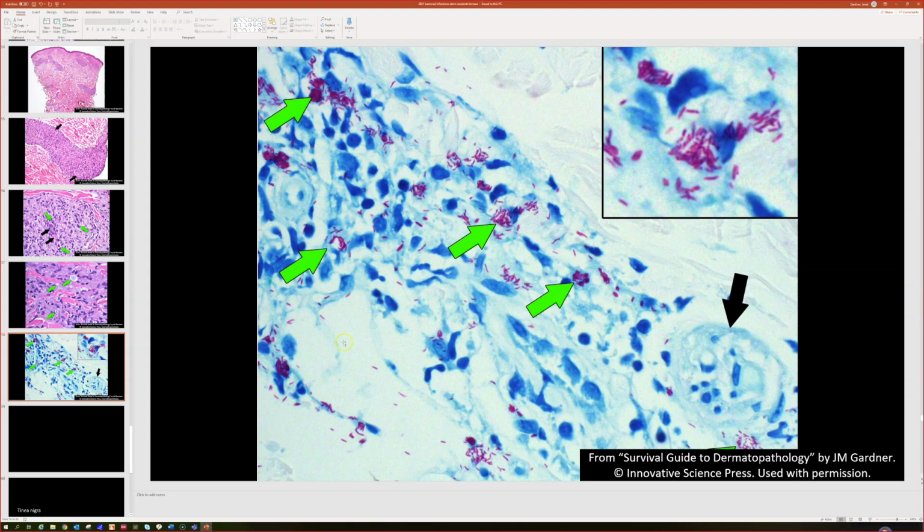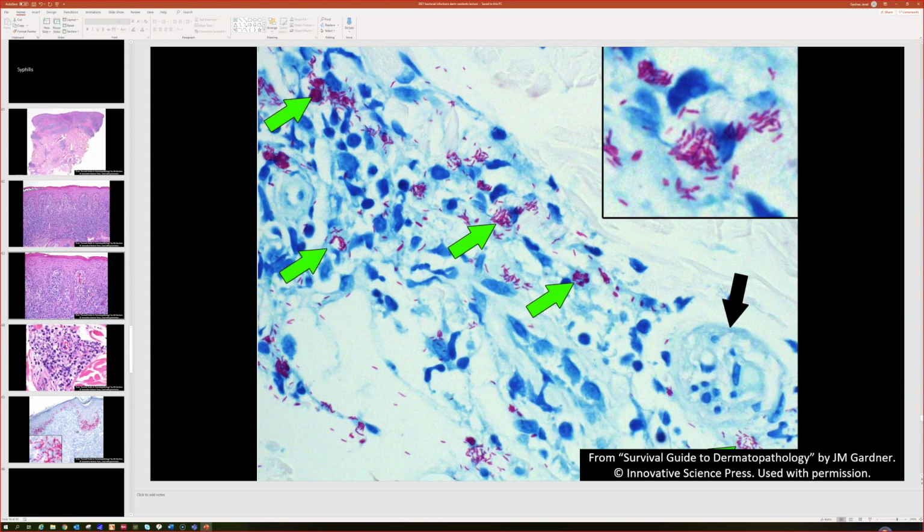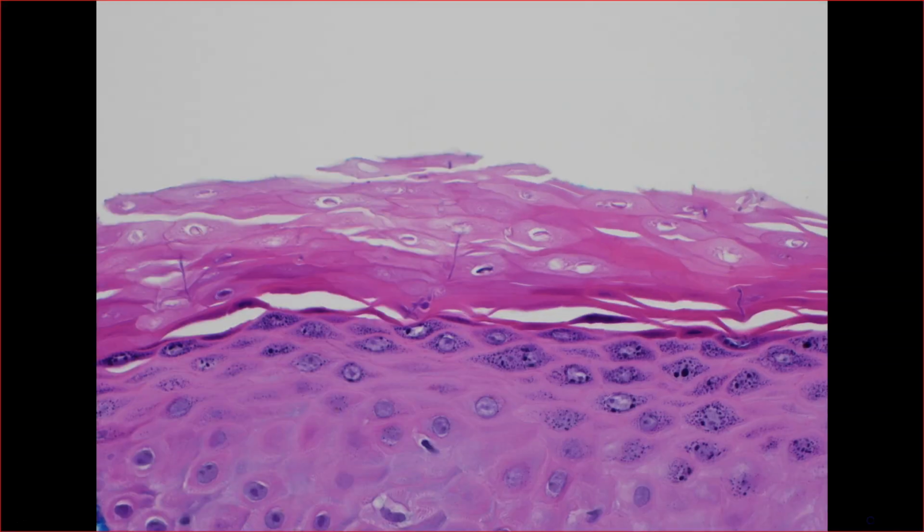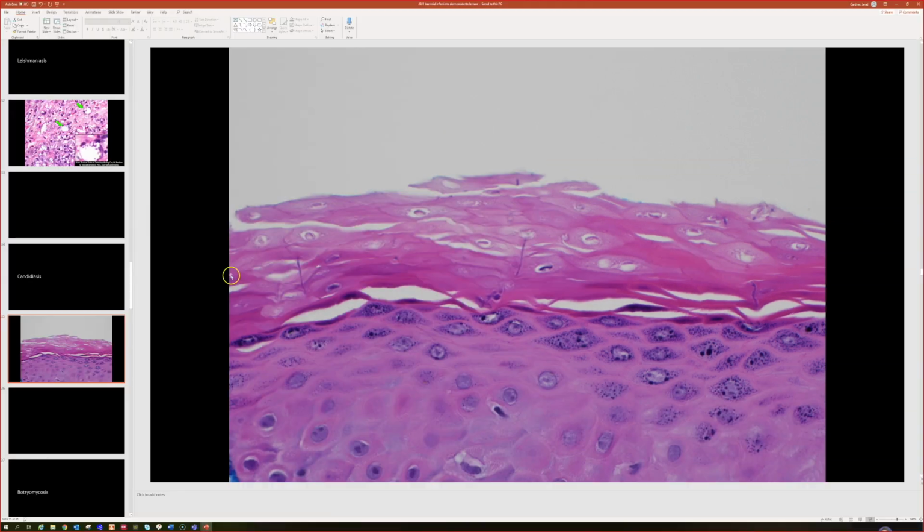And I do have one really nice example of beautiful vertical diving in Candida that I saw not too long ago. Look at that. This was a vulva, and you can see perfect north-south vertical purple fungal hyphae in the corneum, and look, some yeast also. So this is a really nice example of candidiasis. I'm very, very happy with that picture, I have to tell you. I've been looking for that good of an example for years, and I finally found one. All right.